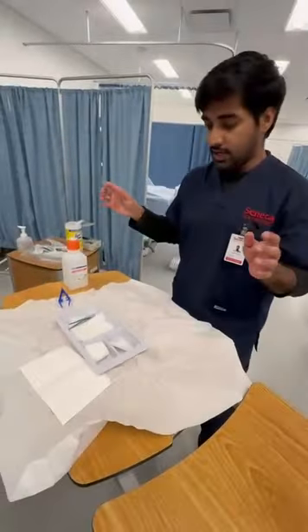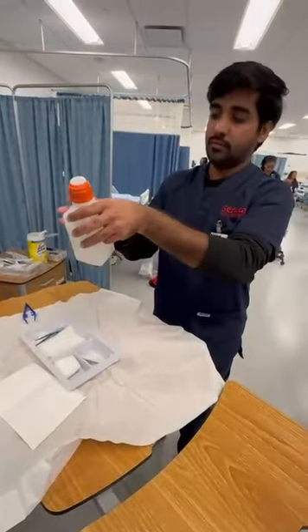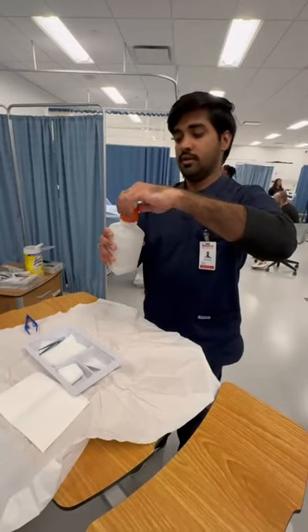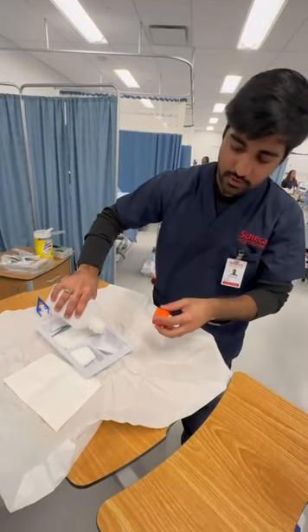Okay, now we have to put some solution in here. This is palm facing the label, so you don't drain anything in here. Open it. Okay, we have the fluid in here.